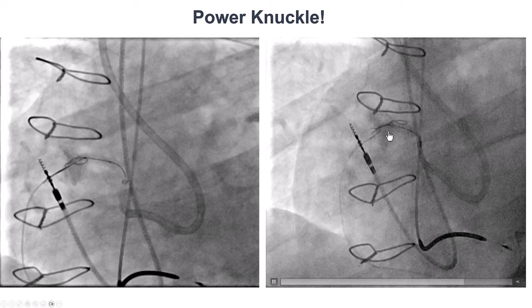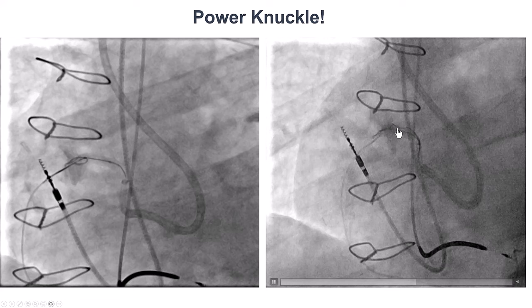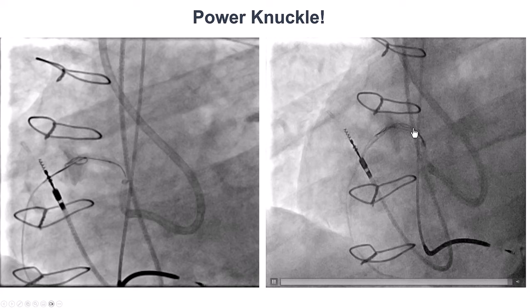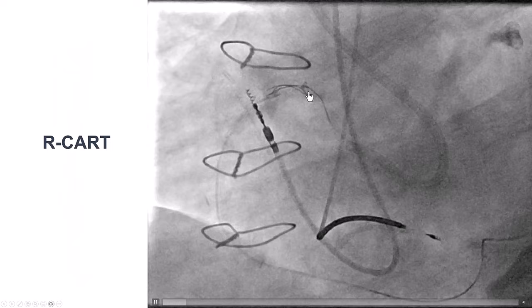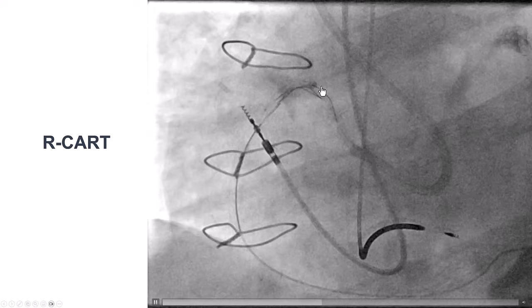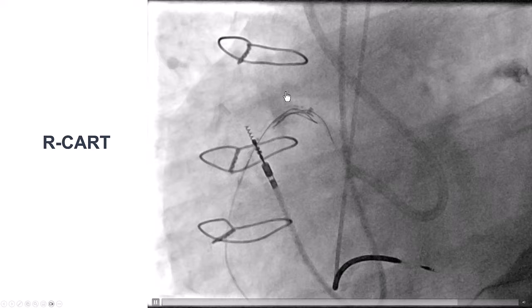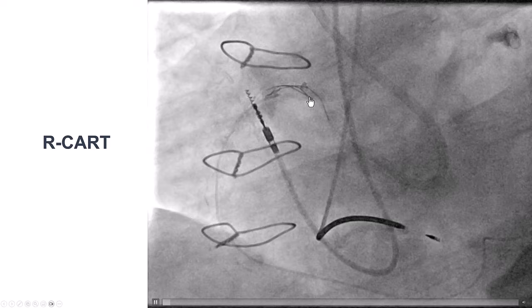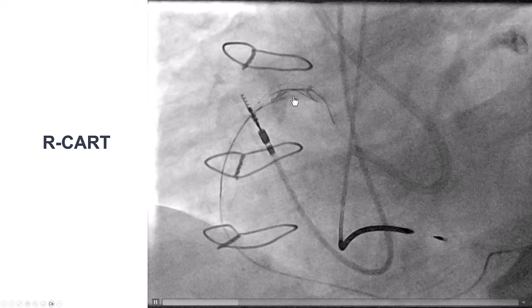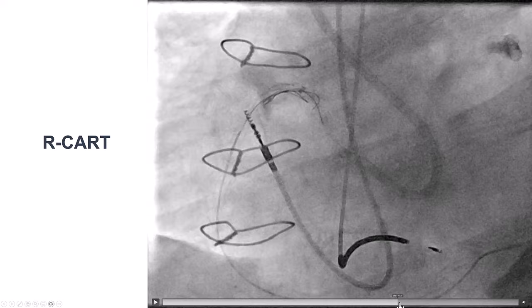Given the poor support, we decided to use the power knuckle technique. We have two wires — a balloon over the first wire, inflated — and then we pushed a Mongo guidewire knuckled, which then entered into the extraplaque space. We did balloon inflation in the extraplaque space and tried various retrograde maneuvers to get into the antegrade guide extension. After multiple attempts — with the wire going outside, knuckling, going outside again, then being redirected — it eventually found its way inside the antegrade guide catheter. This is a matter of persistence, trying again and again with different maneuvers.